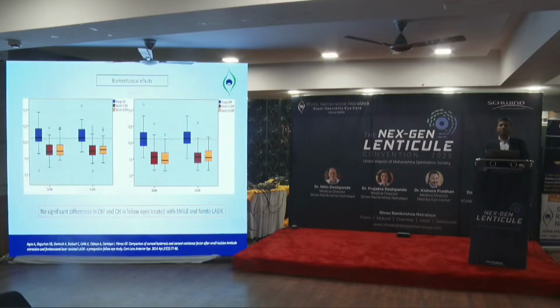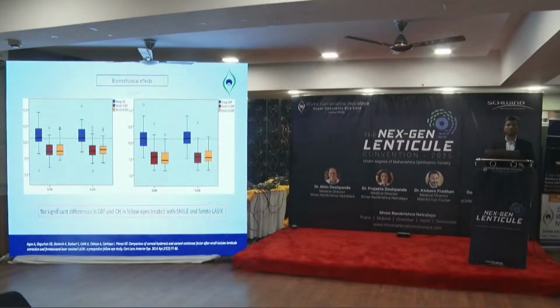There are very limited options available to analyze the biomechanical effects in clinics, such as the ocular response analyzer and Corvis. So there are studies which have been done, and this is a study in which one eye underwent SMILE and the other eye underwent LASIK in the same patient. They analyzed the biomechanical effect with the help of ORA, and post-op for both procedures there is a reduction in corneal resistance factor and corneal hysteresis. So there is no significant difference observed in this study.